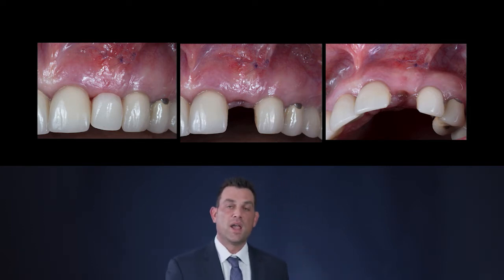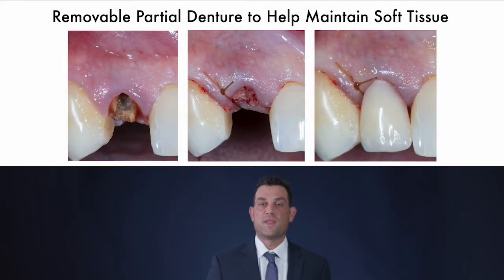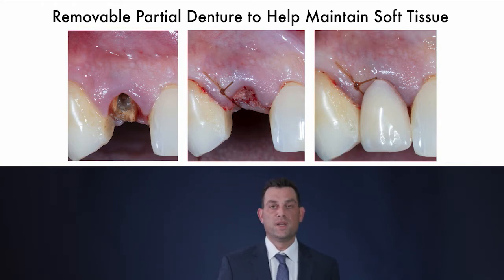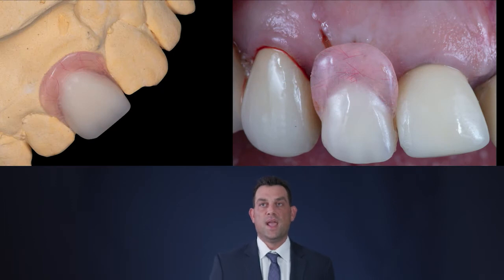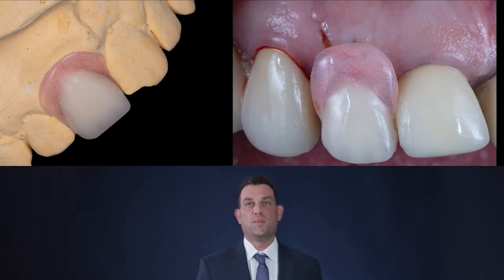As you can see here, I used a removable partial, and this is something that I do quite a bit. Now, it seems very obvious when you look at this picture that that tooth seems to fit pretty nicely into that edentulous site, but this is not usually the way these cases present from the lab. It takes that extra step of communication to make sure that you and your lab are on the same page.